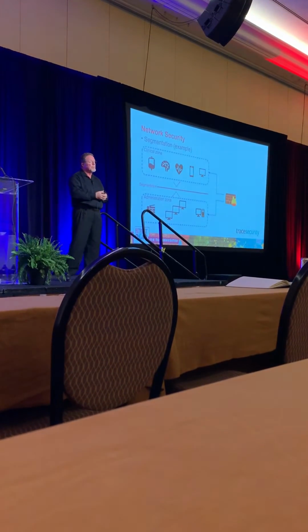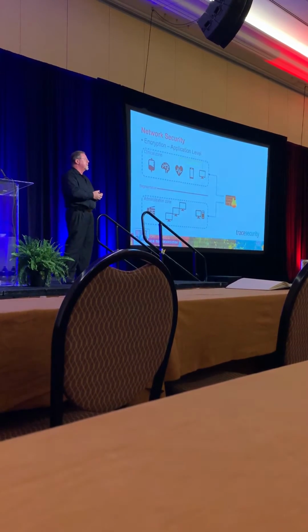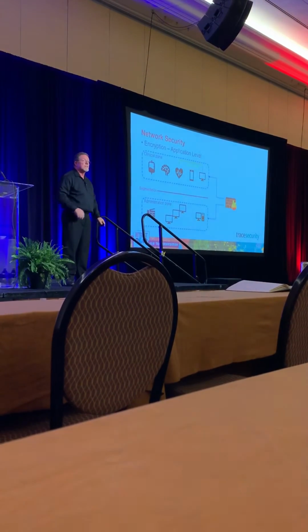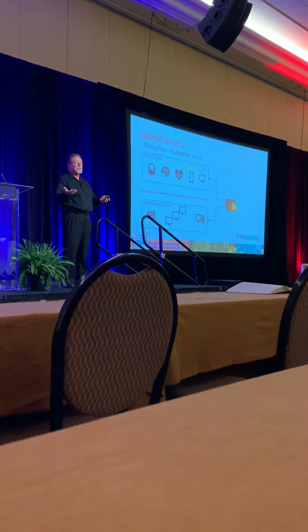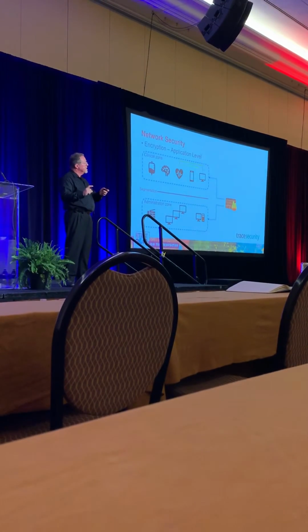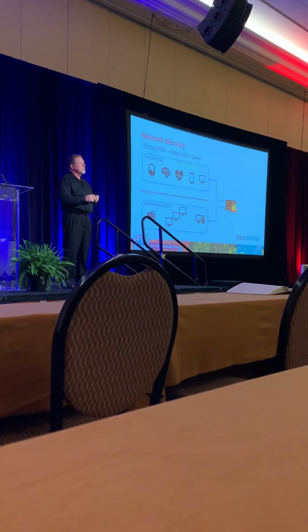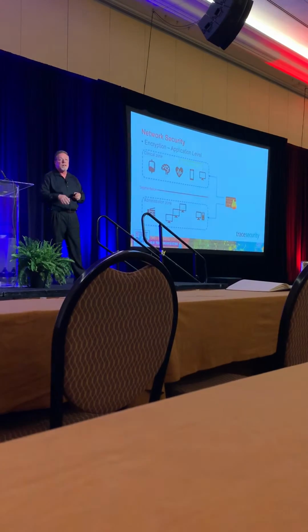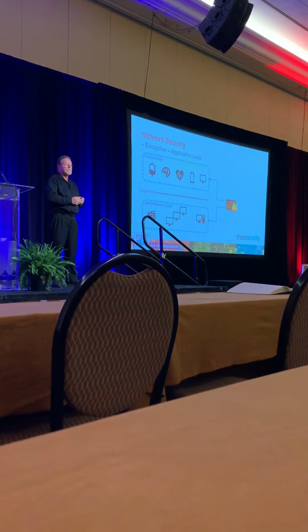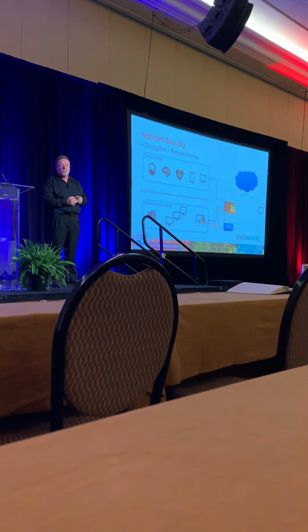So segmentation is important. So real quickly, we've already talked a little bit about encryption. It's not a good idea to send unencrypted data over the network, but that can also happen at the application level. So if you have a workstation where you have an application that's monitoring one or more devices, it's best if you have the opportunity to encrypt that to go ahead and do so. That way that information cannot be intercepted or cannot be easily modified.